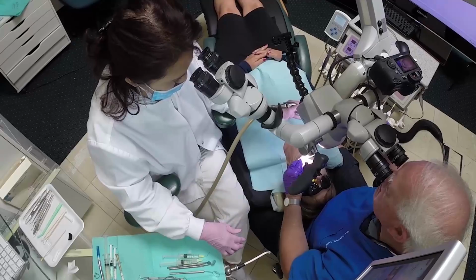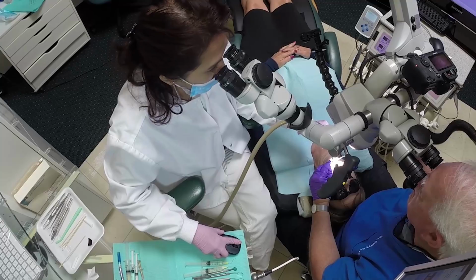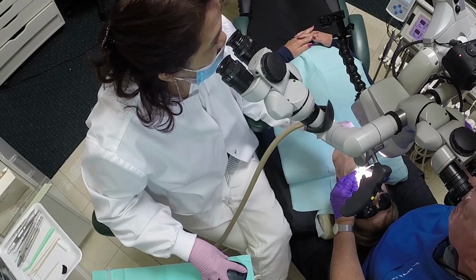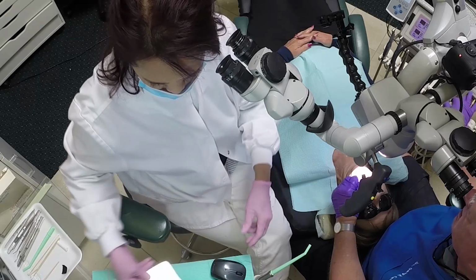During this period of time, Joy will have taken four pictures and also compared an earlier picture from 3 weeks ago on the same patient. During this whole process, Joy is actually taking the pictures and they are going into the record. And it's done. And she takes the mirror and puts it away. So now we're going to actually look at this process in detail.